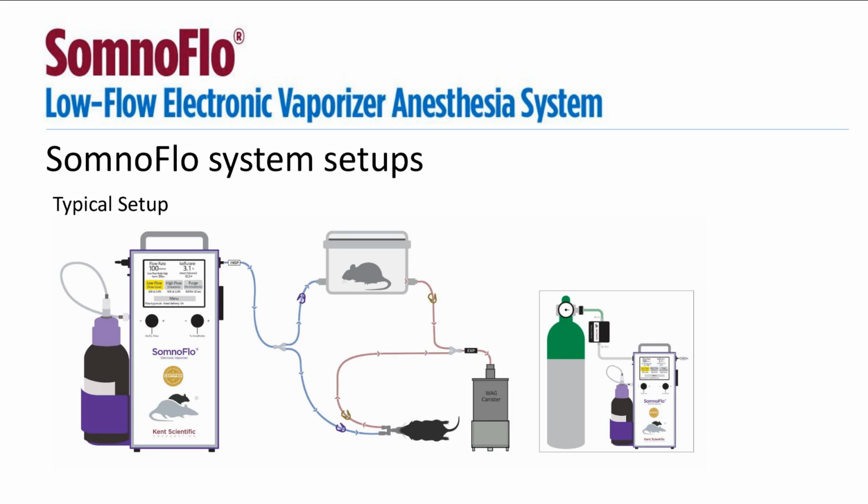Similar to the SomnoSuite, the incoming pressure must not exceed 15 psi if you plan to use a compressed gas. So again, we have our preset pressure reducer here connecting the compressed gas tank to the SomnoFlow.